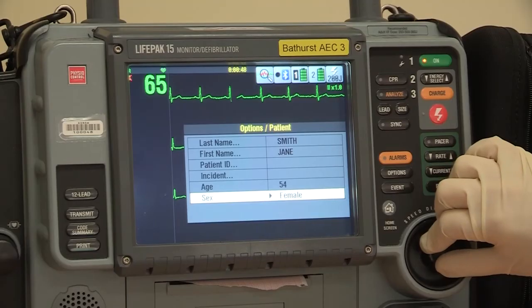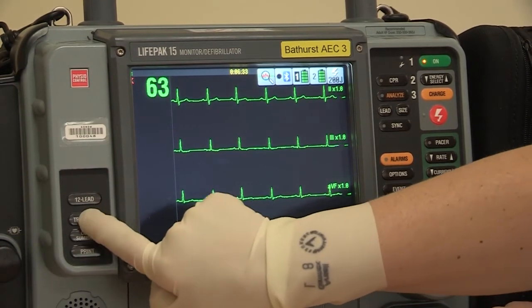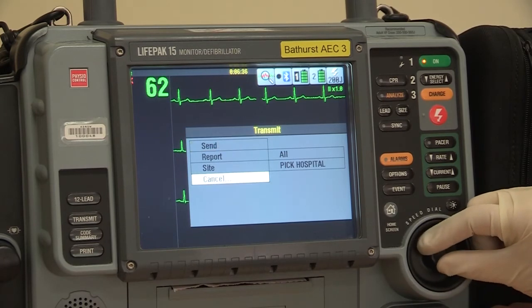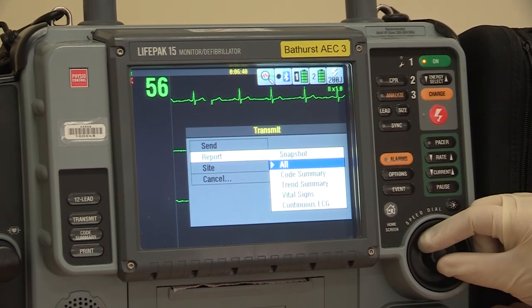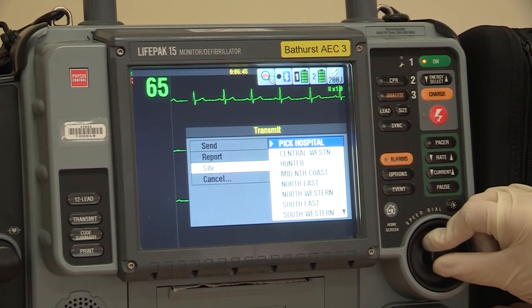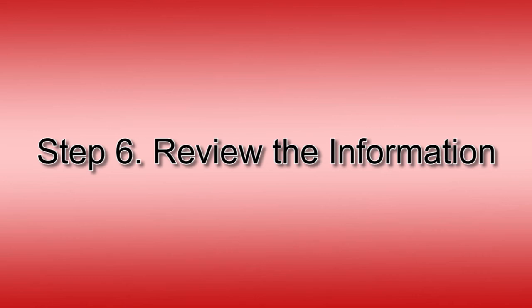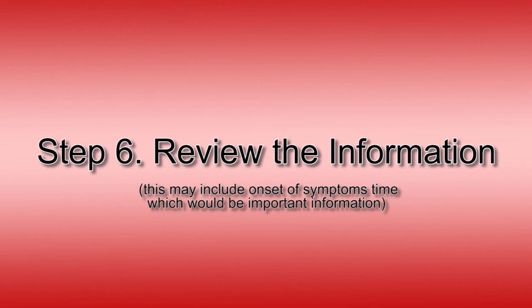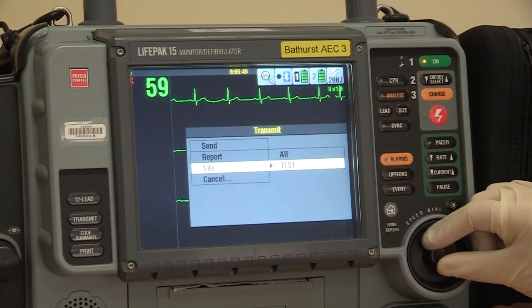If your LifePak 15 has an onboard modem, then this should be easy — just press the Transmit button on the left side and select Report. Then scroll to the site you are transmitting to, as you may be working in a town that has several places who can receive this information. Review the information you are about to send: ensure that the patient's name is spelt correctly and that any other pertinent information is included. Check that the 12-lead is correct and the facility is highlighted, then rotate the knob to the Send button and the machine should do the rest.